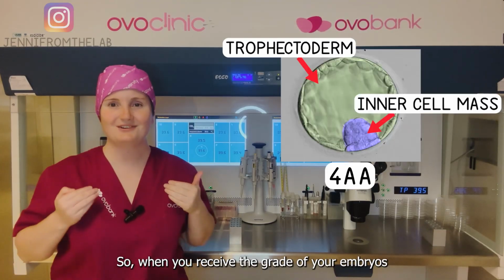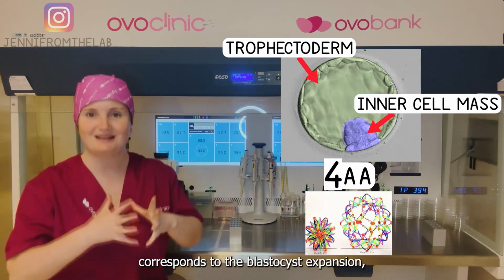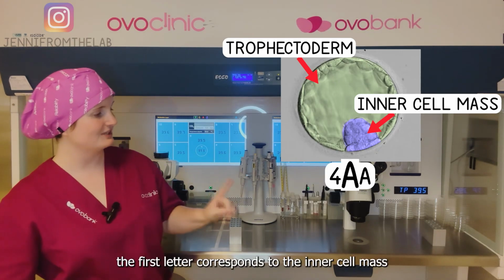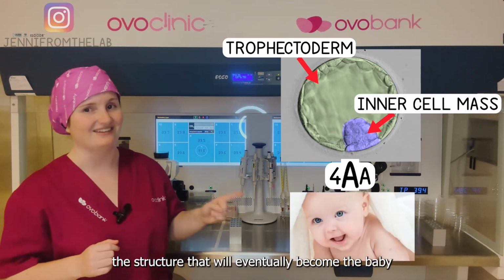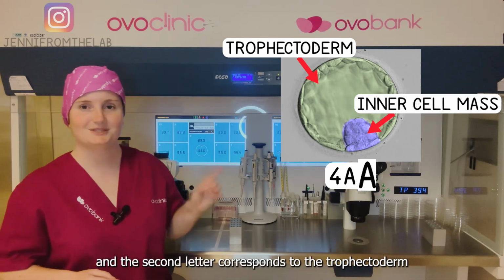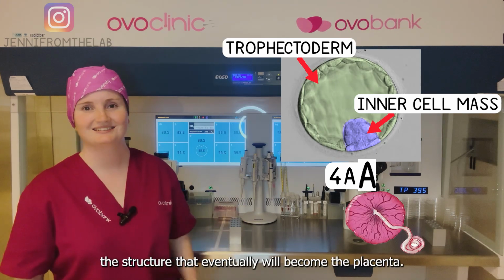So, when you receive the grade of your embryos, now you know that the number at the front corresponds to the blastocyst expansion. The first letter corresponds to the inner cell mass, the structure that will eventually become the baby, and the second letter corresponds to the trophectoderm, the structure that will eventually become the placenta.